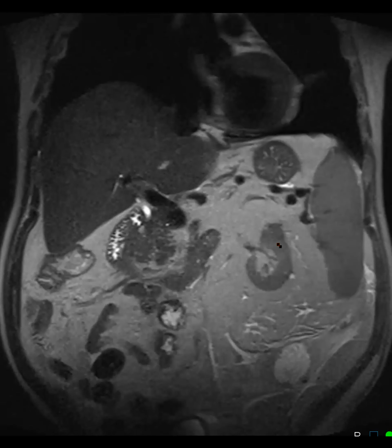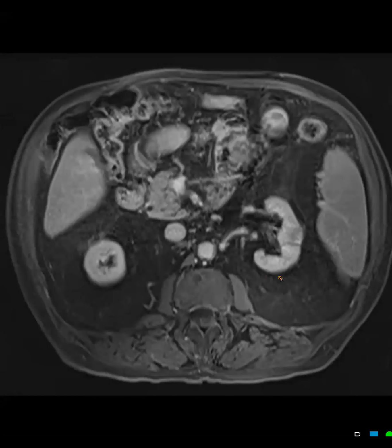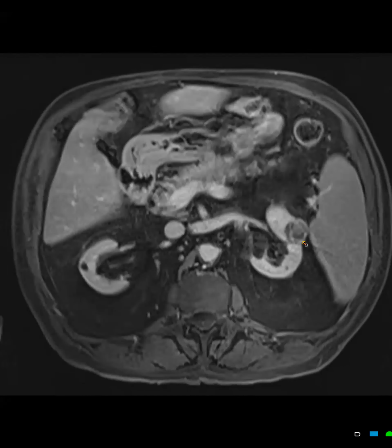This lesion was also seen on the MRI of the abdomen, where there is extensive retroperitoneal fat, and this was the lesion that showed enhancement, and this was biopsy proven retroperitoneal liposarcoma. But the story did not end here, and this patient also had this, which is not biopsy proven, but most likely an RCC, so multiple findings. So anal fistula with mucinous adenocarcinoma, and then retroperitoneal liposarcoma, and possibly low-grade lipomatous tumor in the right gluteus maximus, and also left kidney showing probable RCC. So yeah.